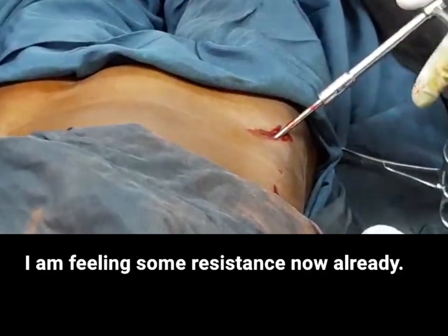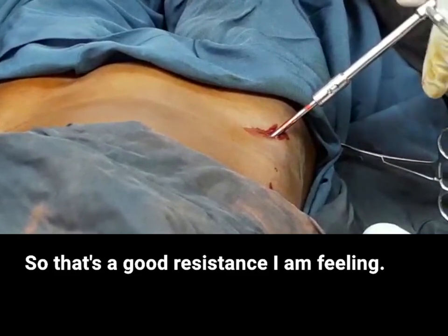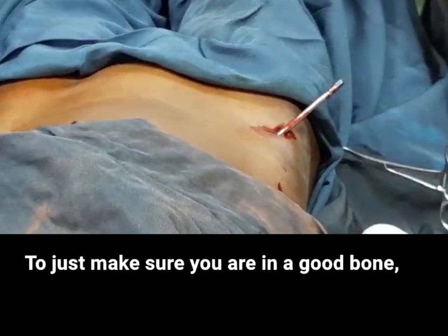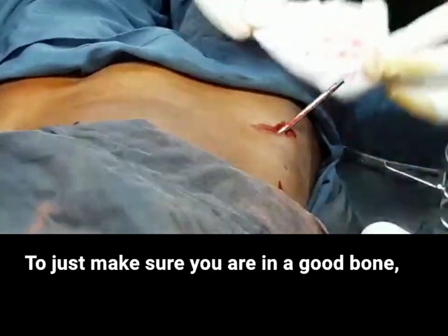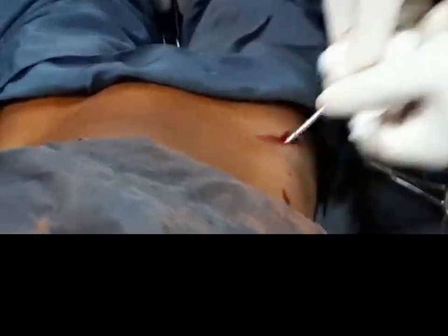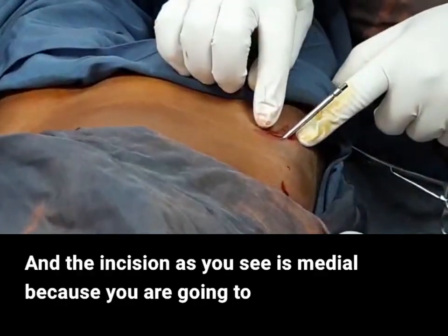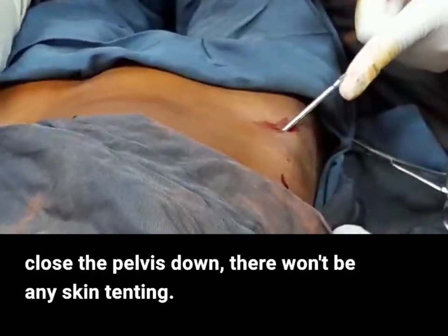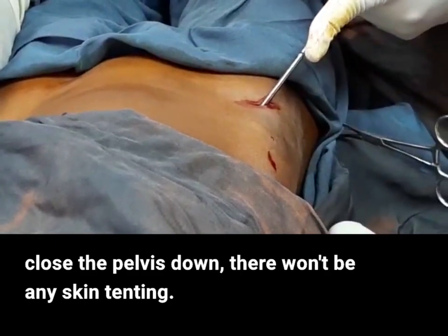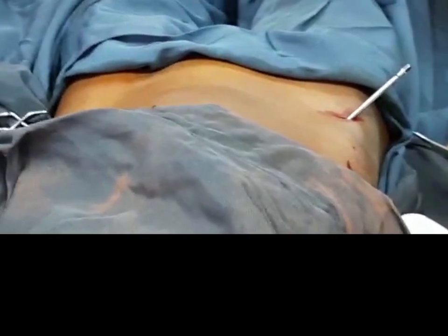I'm feeling some resistance now already — that's a good resistance. To make sure that you are in good bone, you should be able to lift the patient with the pin like this. I'm comfortable with the way this pin is placed. The incision is medial, and because you're going to close the pelvis down, there will not be any skin tenting. I will do the same thing on the contralateral side.